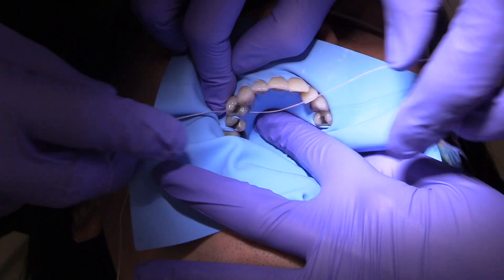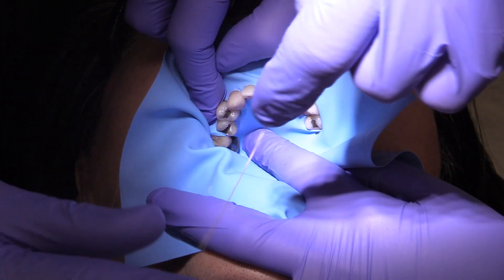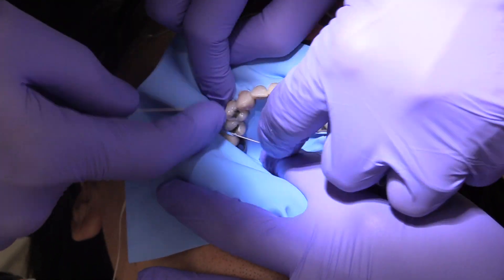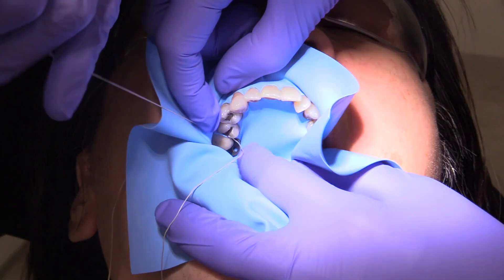Here's another one. Look how the floss is on the distal of five and then not hitting the rubber dam. Once again, we're going to be either pushing or pulling here, so we're going to go up against the distal of number four.